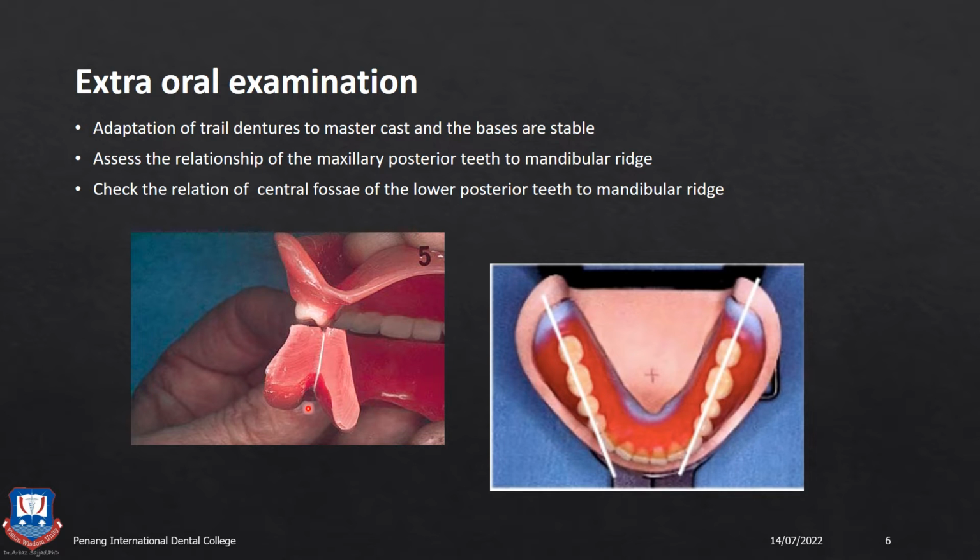You need to verify whether there is any wax or dirt or debris underneath the denture, and whether there are any sharp edges that may hurt the patient or make him uncomfortable. All these things, and the proper sculpting of the wax: whether it is smooth, and whether the cameo surface and the intaglio surface meet each other smoothly. It should meet like a fish belly.